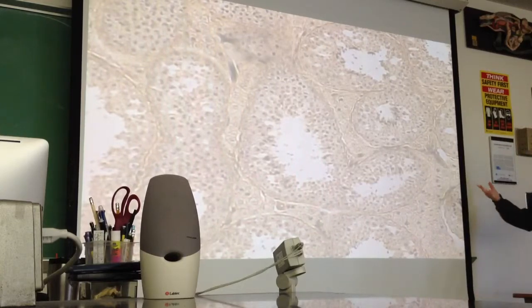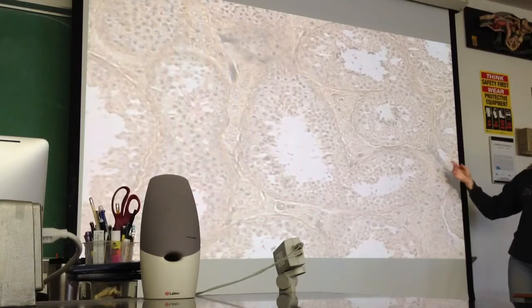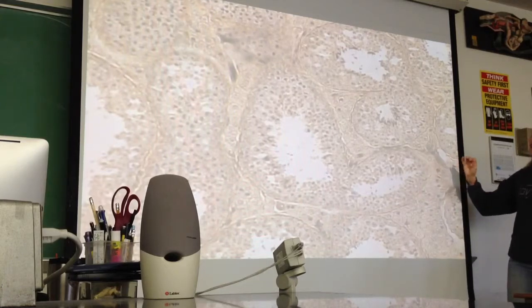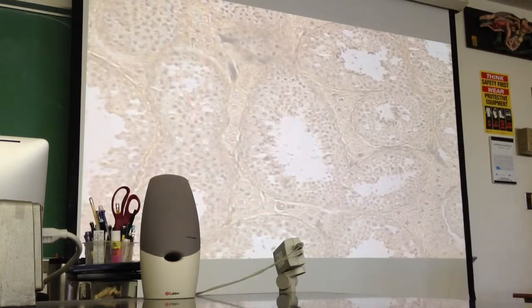Once they get to the center, they travel through the entire maze of seminiferous tubules, because this is seriously just a whole coil of seminiferous tubules. They travel through all of that, and their tails won't become motile until it's time for them to be released. So they just kind of have tails for fun at this point, and eventually they'll use them. They just get pushed through the system with different currents and things.